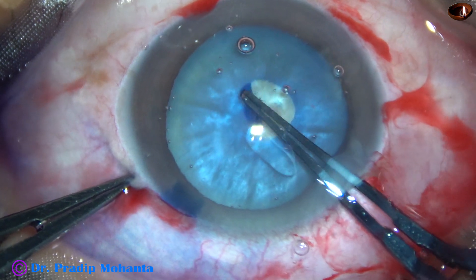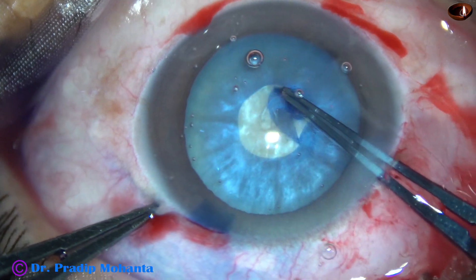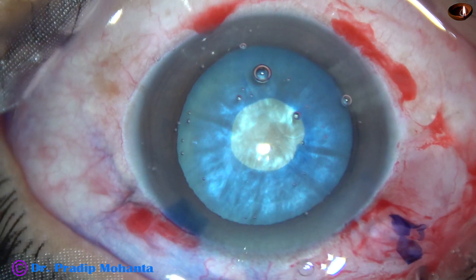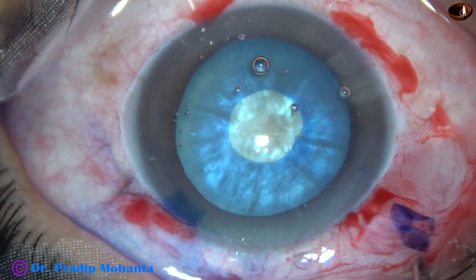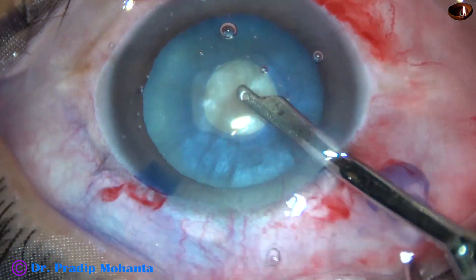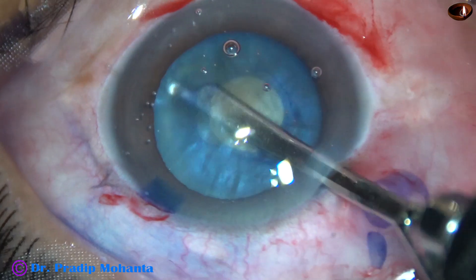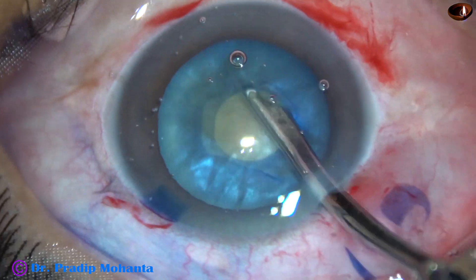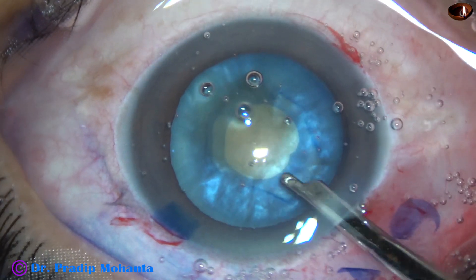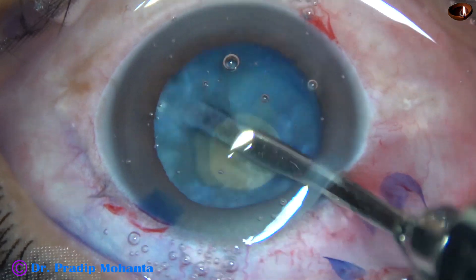Some oily fluid has come out, and this indicates high intralenticular pressure. To reduce the intralenticular pressure, some anterior cortical lens matter is aspirated with the help of a Simcoe cannula.